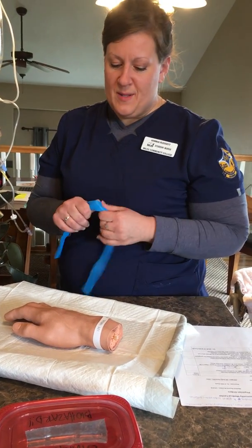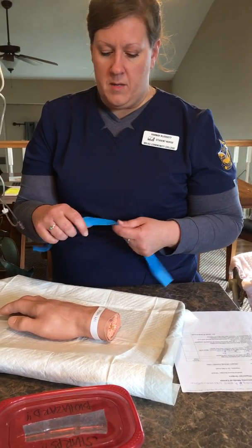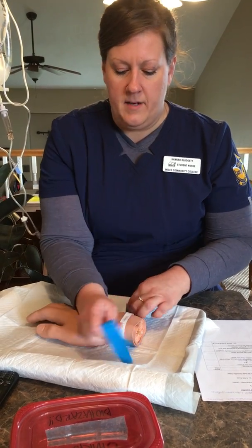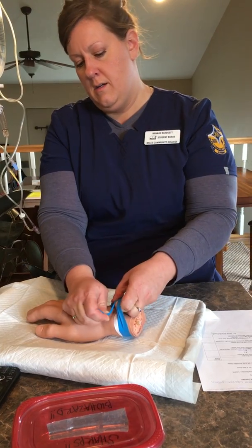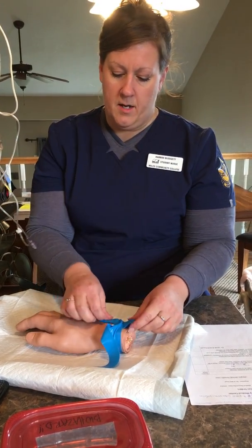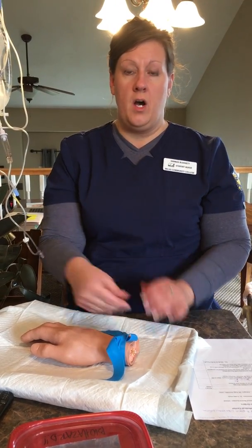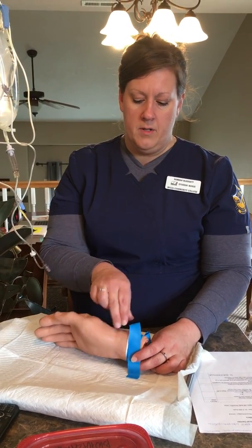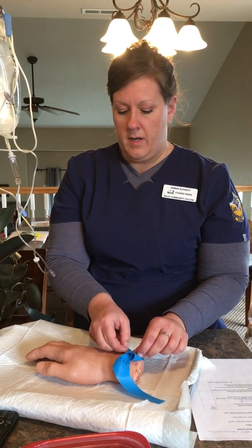So again, I would double check with the patient. Could you state your name and your date of birth, and verify it with their name band. Once that's verified, I'm going to go ahead and place the tourniquet on, making sure that it is tight. If you were to do the location in the arm, you would make sure to palpate the radial pulse to make sure that you don't have it on too tight, that they're actually still getting some flow through their vein.